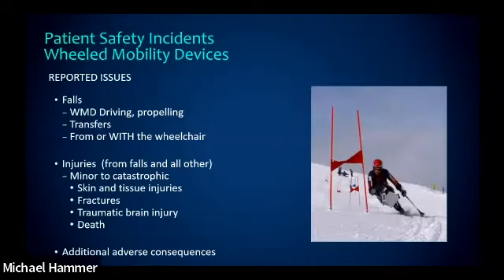This is an individual who is one of our world-class skiers, 6-time Paralympian. And so when you're that type of individual using a manual wheelchair, literally chasing the snow and skiing more than 200 days a year, and now experiences a fracture, they're out of that game, but also everyday life of transferring, getting in and out of bed, dressing, taking care of themselves. You guys are all nodding your heads going, this is a real significant issue for the folks that we're taking care of every day.